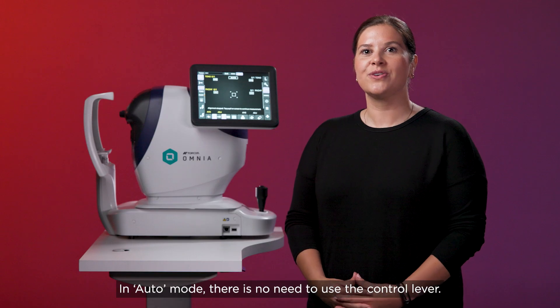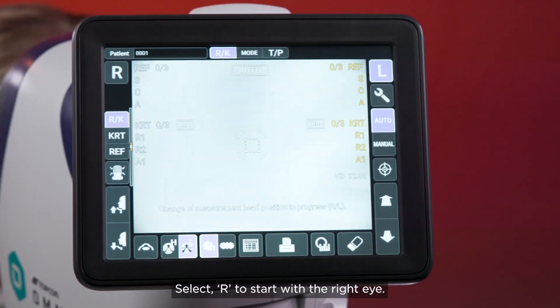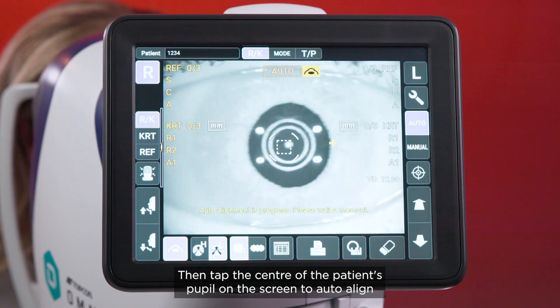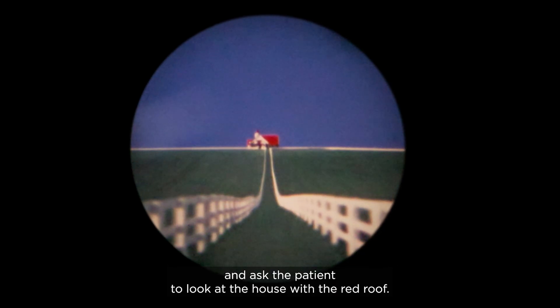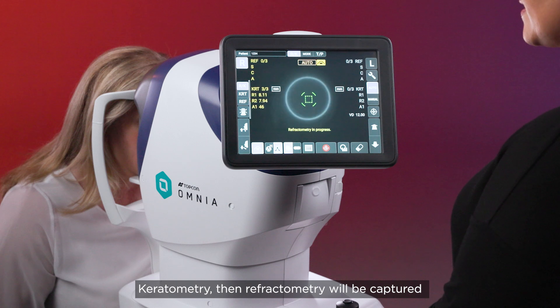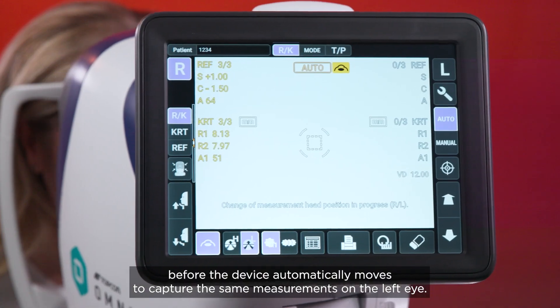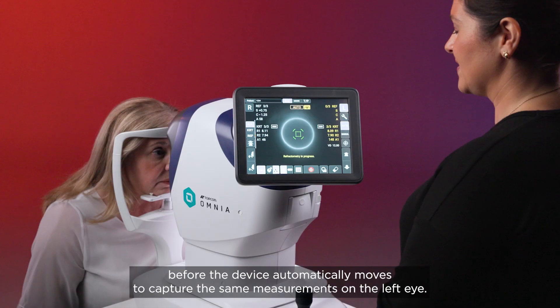In auto mode, there is no need to use the control lever. Select R to start with the right eye, then tap the centre of the patient's pupil on the screen to auto align, and ask the patient to look at the house with the red roof. Keratometry then refractometry will be captured before the device automatically moves to capture the same measurements on the left eye.